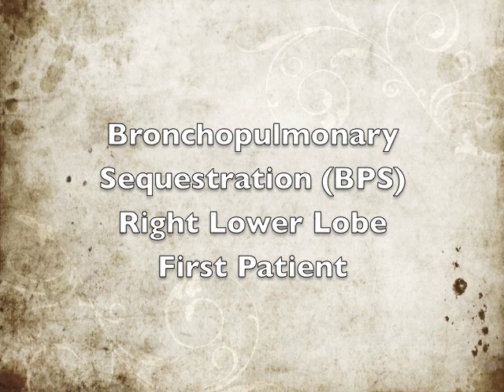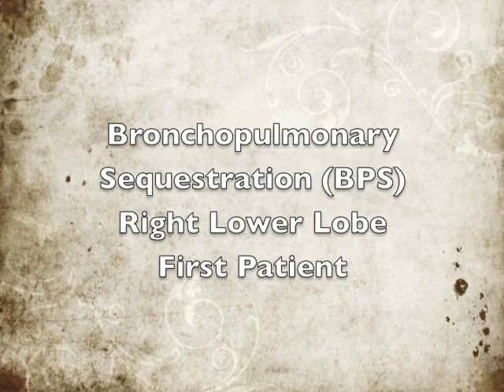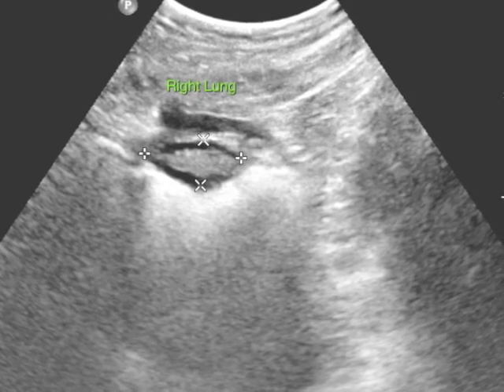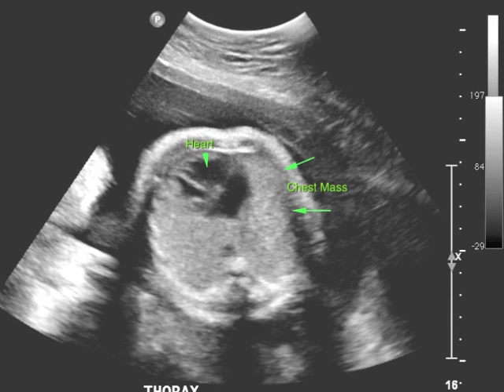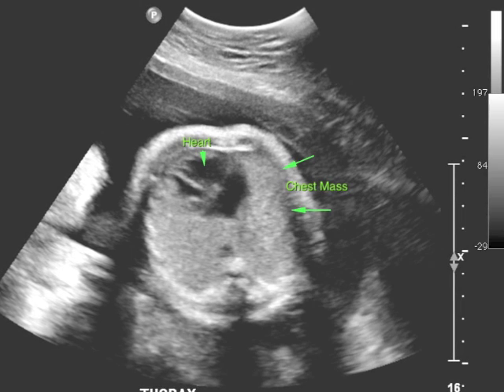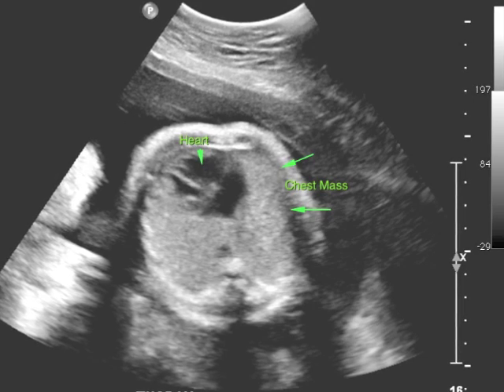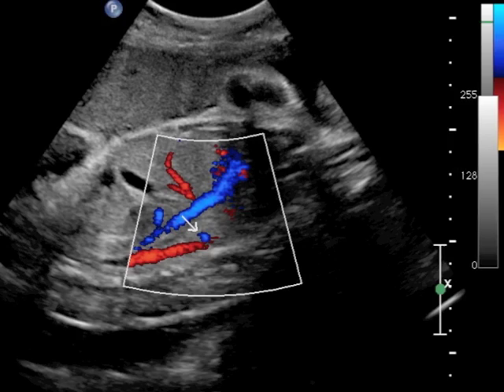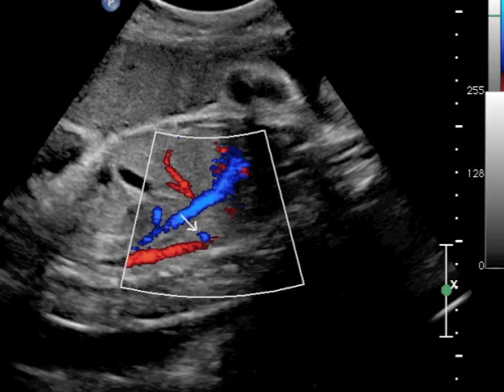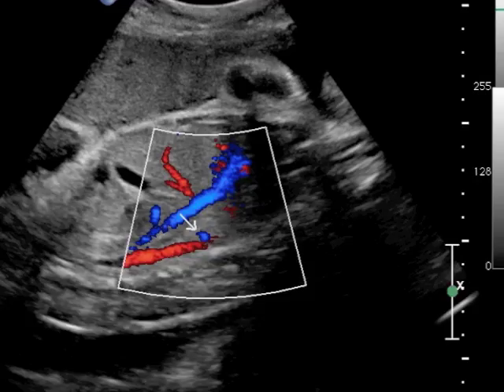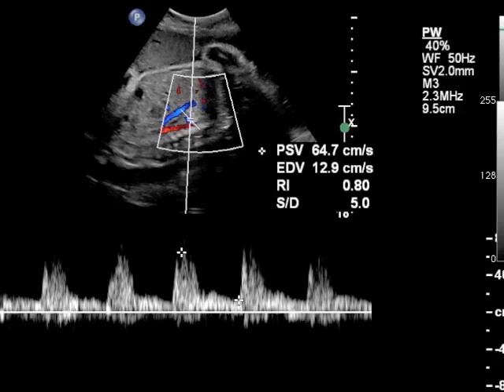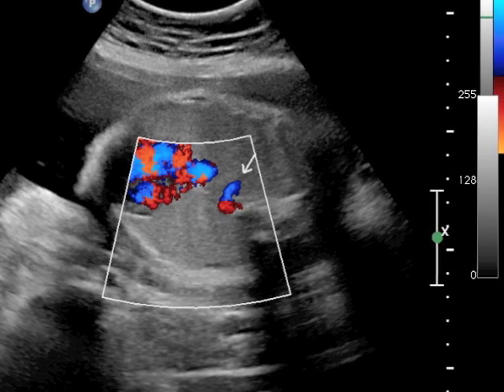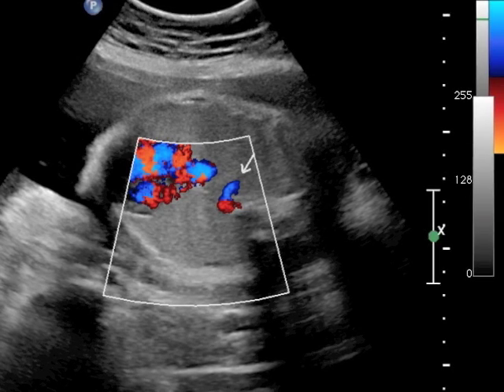The first case was discovered on a regular obstetric ultrasound performed at 34 weeks of gestation. The ultrasonographer noted a distinct mass within the right lung. On the axial images, this hyperechoic segment is more apparent, identified here with the green arrows. A green arrowhead points to the heart for orientation. The color Doppler images demonstrate a distinct vessel arising from the aorta and feeding this abnormal segment. You can see the aorta as the larger red vessel at the bottom of the image. Additional images show the arterial waveform and another view of the abnormal vessel feeding this abnormal segment of lung.